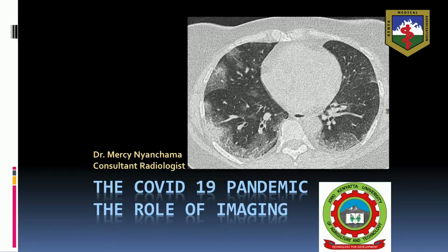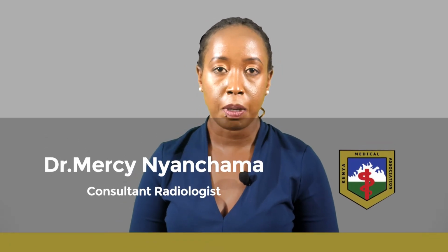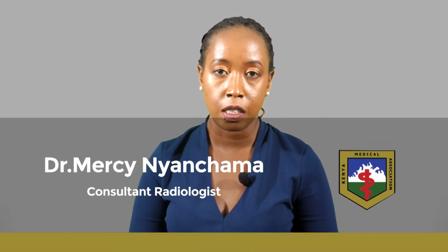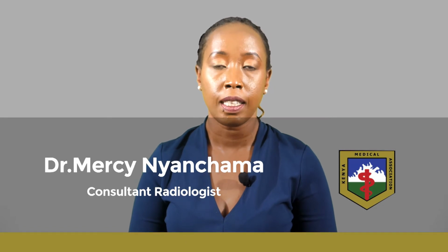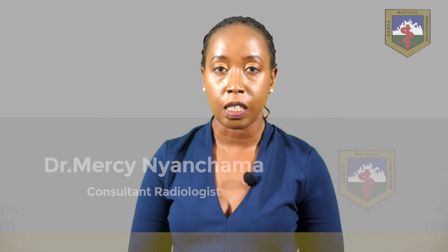I would like to thank Kenya Medical Association for giving me this opportunity today to give a talk on the role of imaging in the COVID-19 pandemic. My name is Dr. Mercy Nyanchama. I am a lecturer and I chair the Department of Radiology in Jomo Kenyatta University of Agriculture and Technology. And I am also a consultant radiologist at Kiambu Diagnostic Imaging Services Limited.